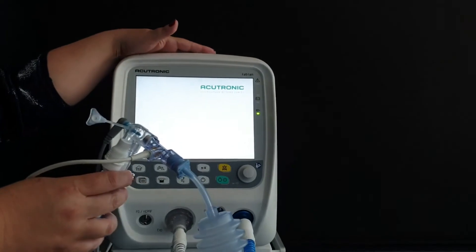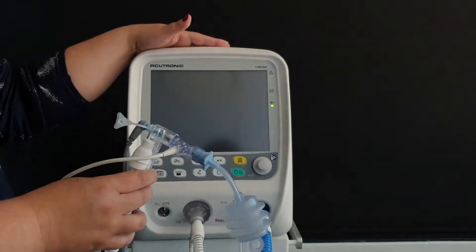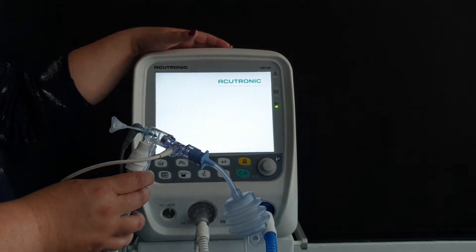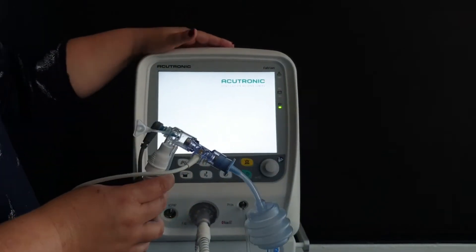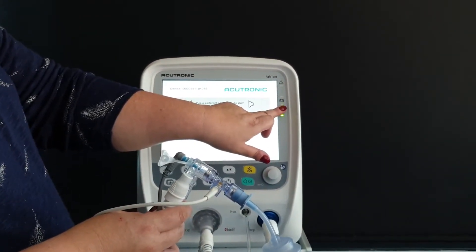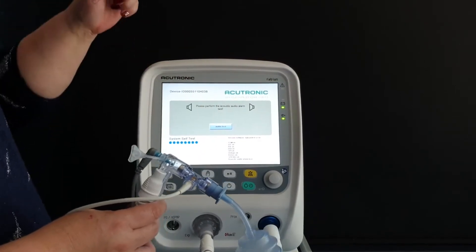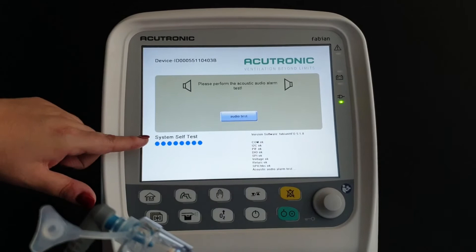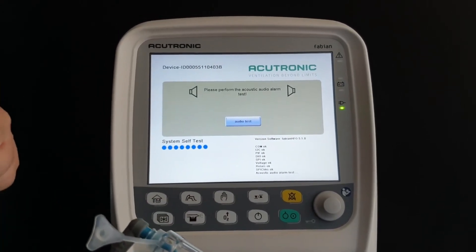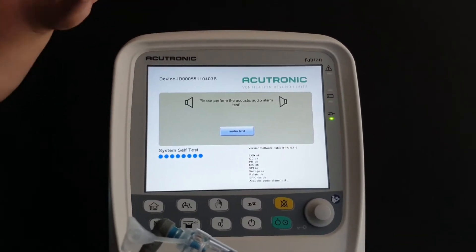The machine is booting up — it is quite quick and does not need to stand on for long. On the side of the machine you can see indication lights showing it is connected to electricity and the battery is currently charging. When you switch this machine on, you cannot proceed without completing the system self-test. The machine is automatically testing for pressures, leaks, and the electronic components — there is nothing you need to do manually.